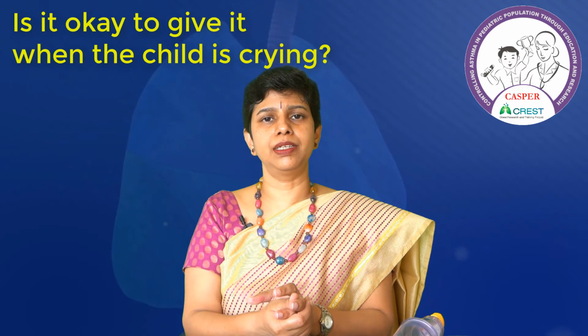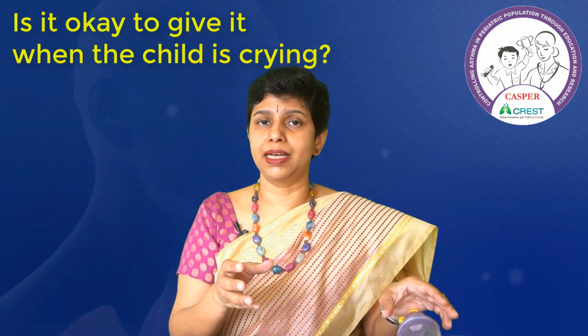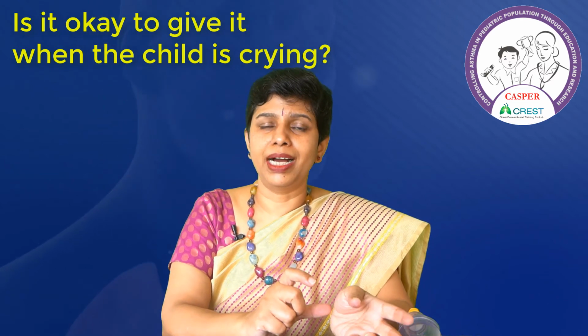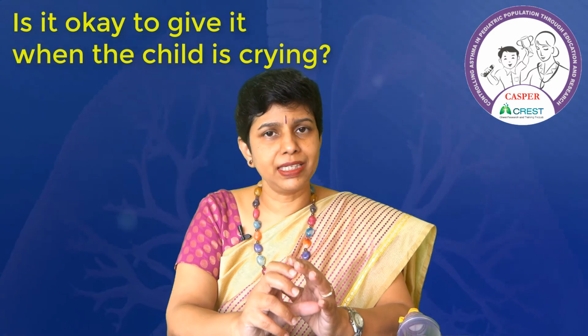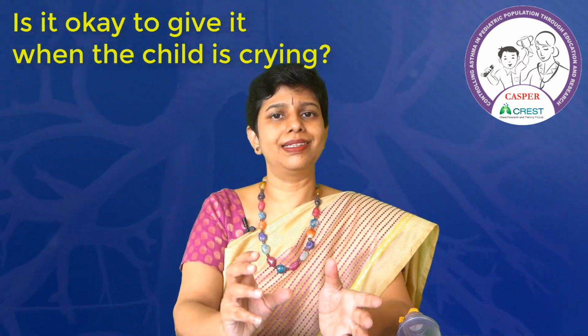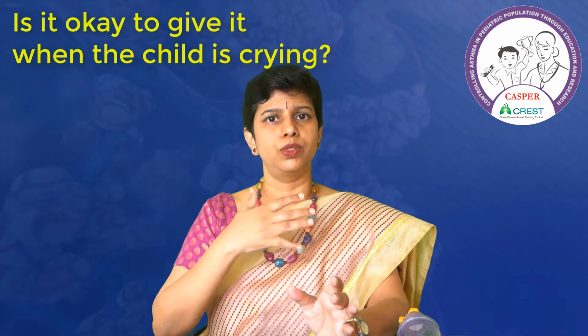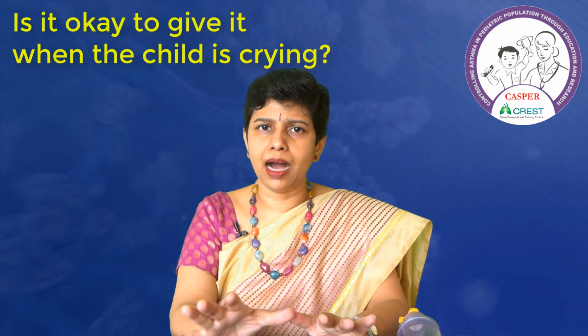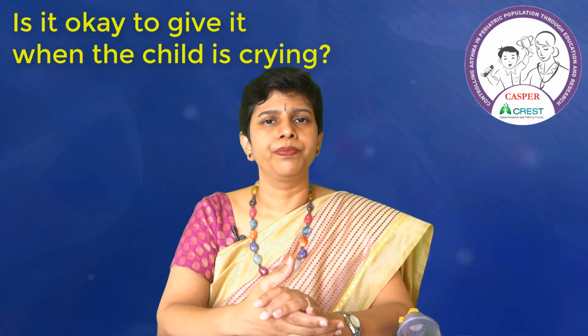When the patient is inhaling while crying, studies with radio-labeled inhaled medication have found that the drug goes more into the stomach than into the lungs. So it's better to make the child calm and quiet and only then give the inhaler.